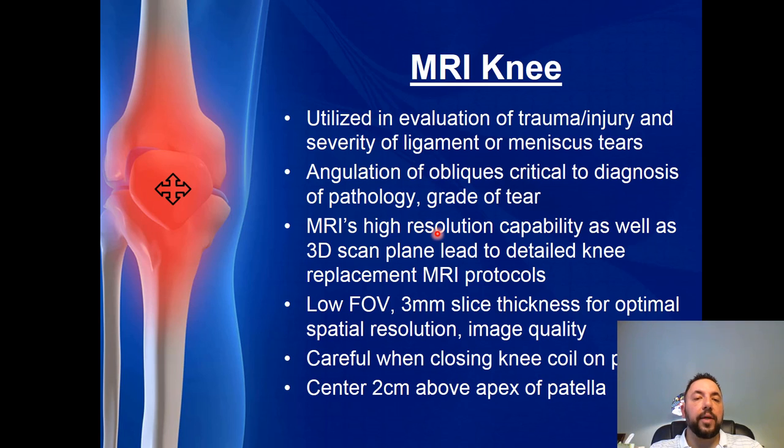I will say one thing, especially when there are larger knees, be very careful when closing the top of the knee coil on the patient that you don't pinch the skin. So be very careful when closing that knee coil.